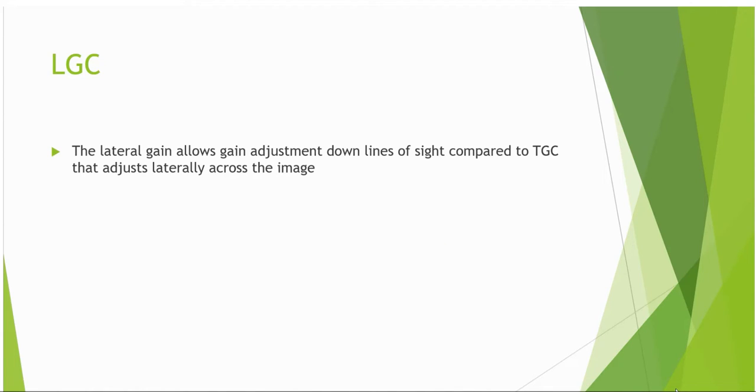Most machines these days have an automatic gain function such as TEQ, iScan, and ATO. The system may try to uniformly adjust the gain for the screen, either at the press of a button or with automatic and constant updates. These functions work very well and may adequately adjust the display for us. However, they are not a replacement for our gain settings. A user will often be able to override this process and improve the image to their liking or, in a way, best display the point of interest in a study.